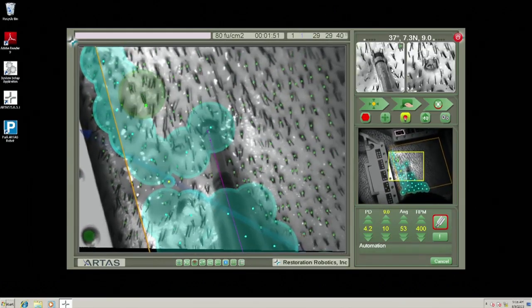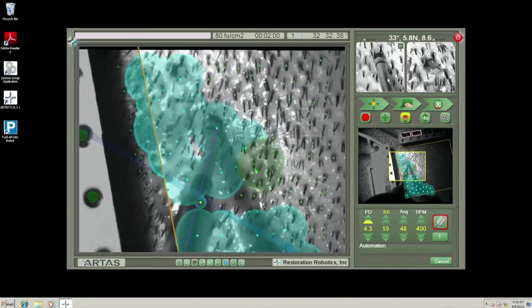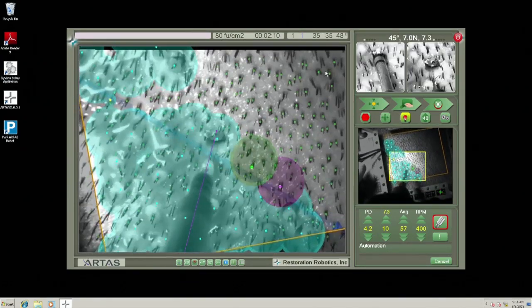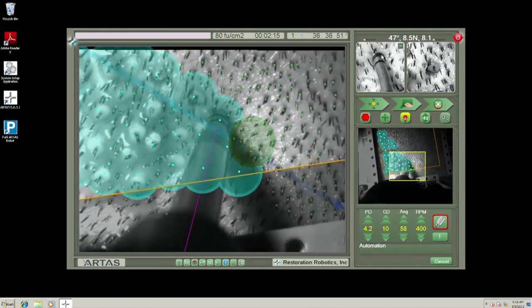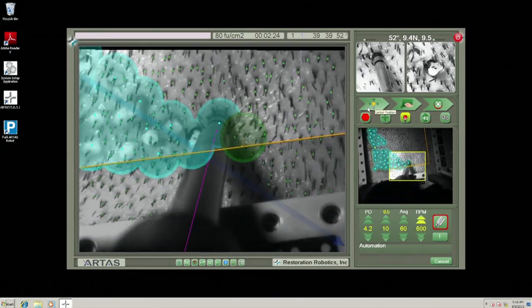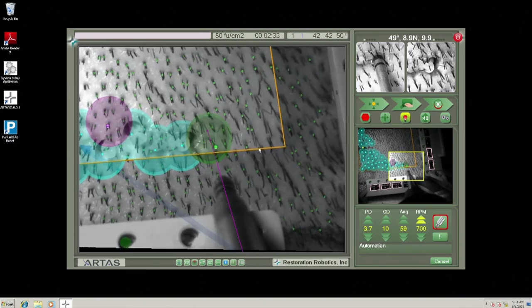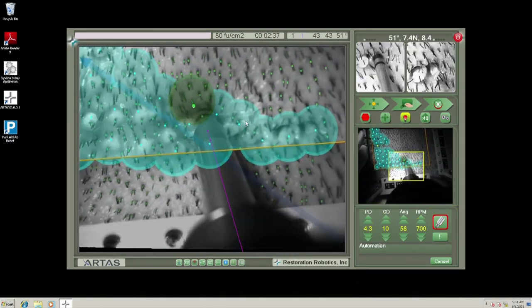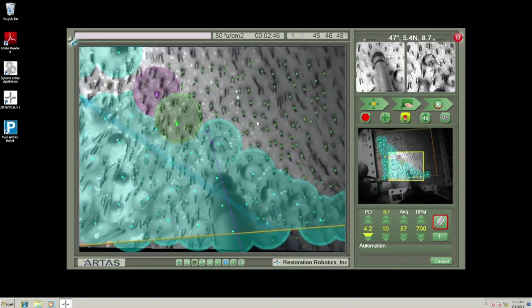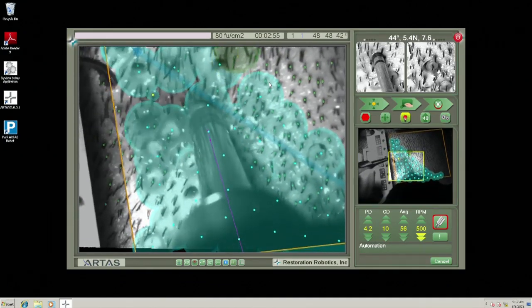That's correct. There are two things that are happening here. If you notice where my mouse is hovering over this dissection, this is the dissection that has just occurred, and it's showing you the inner sharp needle. It has two lines on it. The lines are associated with how deep that needle, that sharp device, is going in and scoring the skin. If we know that this is what we refer to as the skin line, we know that it's perfectly calibrated to break the surface of the epithelium, but not have that sharp needle go in too far, which would of course increase our transection rate. Then as soon as it scores the epithelium and the first layers of the skin, it's followed by a dull device on the exterior that cores down. It's a rotary 360-degree dull device, very similar to the SAVE system developed by Jim Harris. It's just a dull punch, and it goes down around the outside, and that prevents the follicle from being damaged, or at least minimizes the chances of any type of instrumentation damage.